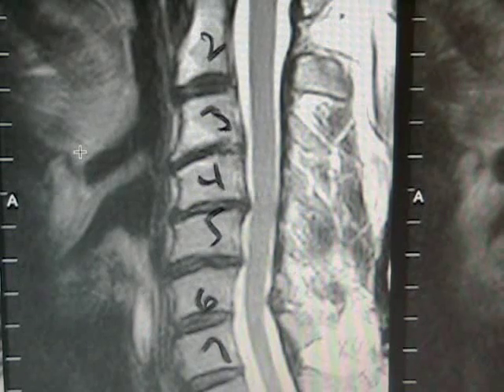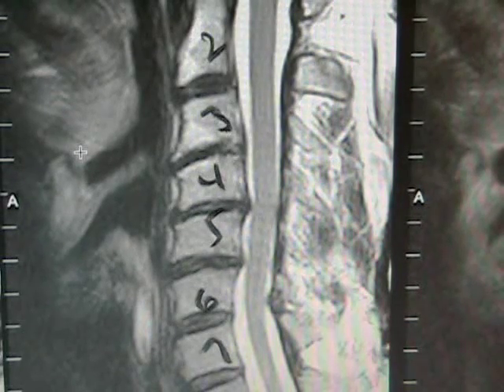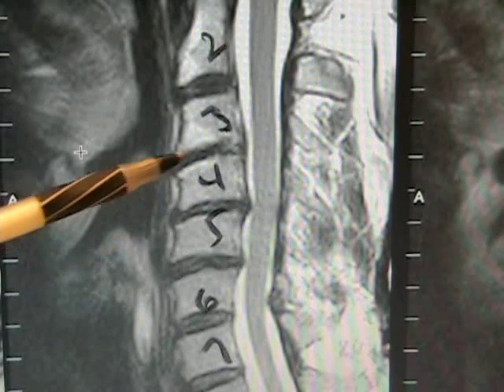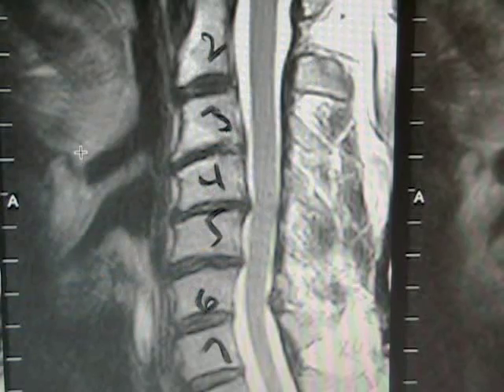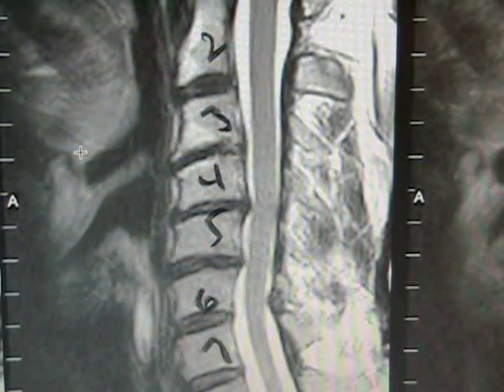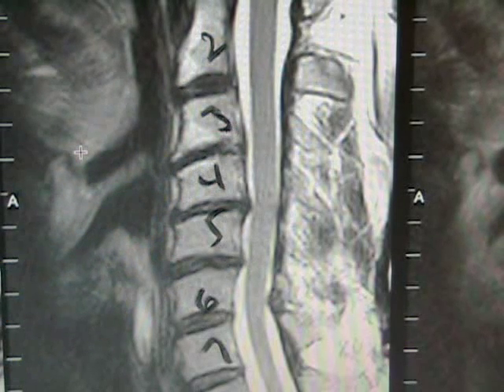This is a side view, or sagittal image, of the cervical spine, and in this case we can see that not all the discs are perfectly normal in size. We see narrowing of disc spaces at multiple levels. We have a little bit of bone spurs going back towards the spinal cord, but it appears that the spinal cord gets through without any compression effect. These changes in the vertebral bodies themselves are what we would call diffuse degenerative changes, also some arthritic changes. The terms are sometimes used interchangeably.